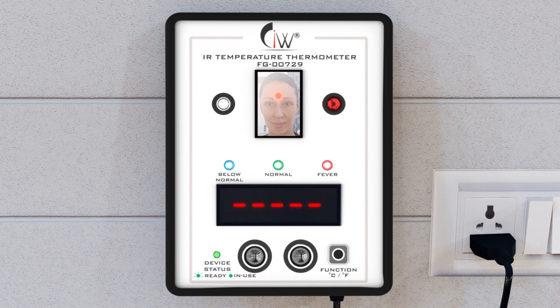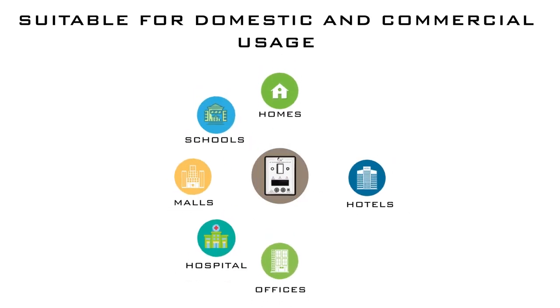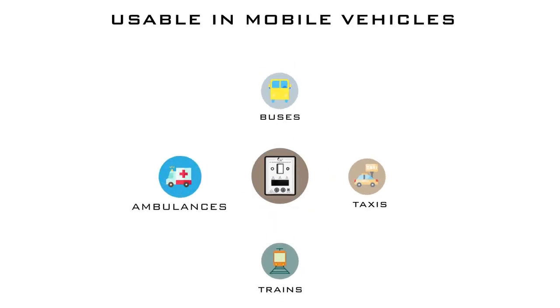The green signal with a beep indicates that your temperature is normal. A red signal with a long beep indicates fever, and a blue signal with multiple beeps indicates temperature below normal. You can change the default Fahrenheit mode to Celsius if needed with the press of a switch. This device is suitable for domestic and commercial use and can also be used in mobile vehicles with a 12-volt battery.